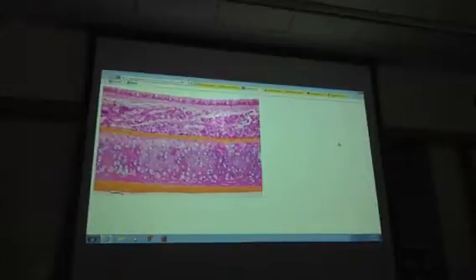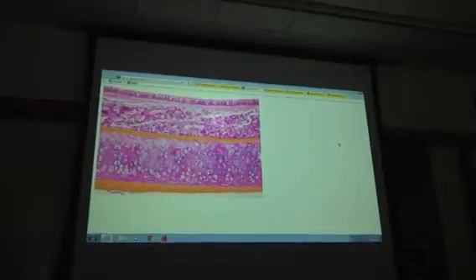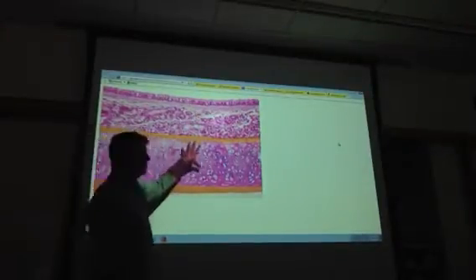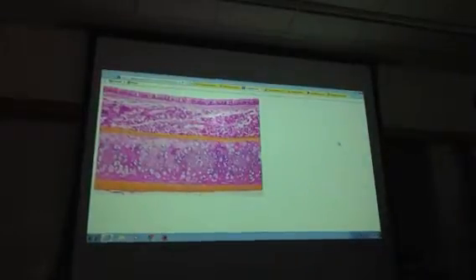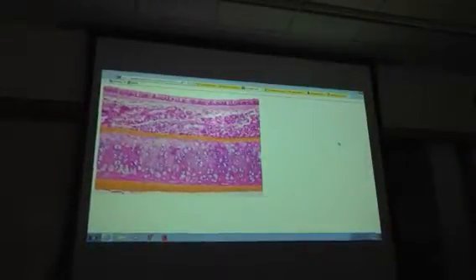That's where you find the seromucous glands. Okay? All those things that look like little donuts or little circles, that's the seromucous glands. Then you get into the hyaline cartilage. And then out here, it's not really shown, would be your connective tissue layer that has the adventitia. I don't know, is that something you had to know? No, that's not even anything you had to worry about.